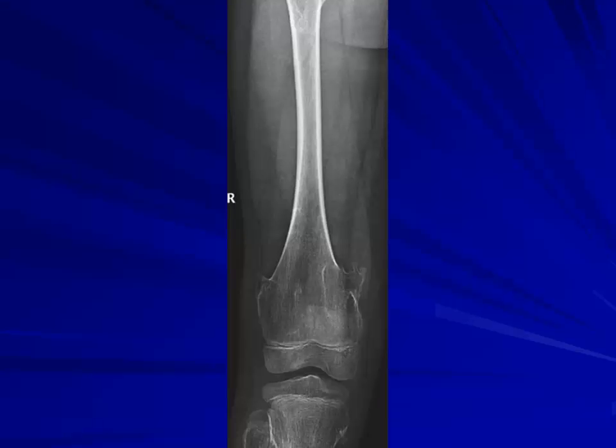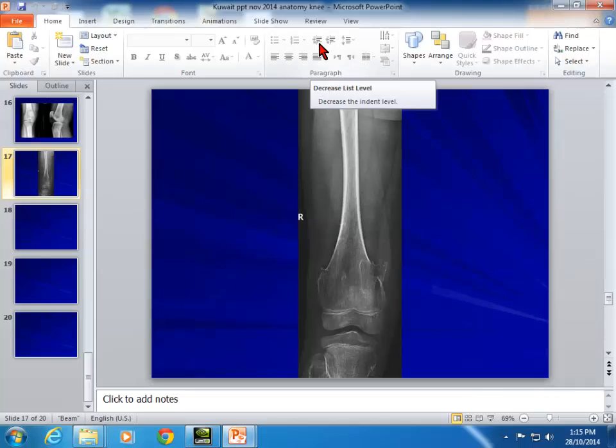That's why in imaging it's very important that you do two projections. Even in nuclear medicine, if you're seeing something on AP, you say, okay, let's look at the ribs from the lateral. Even in the head, the skull, if you see AP, you don't know where the lesion is, you cannot localize it. So you do a lateral, and you say, oh, this is in the posterior or the sphenoid rather than nasal.